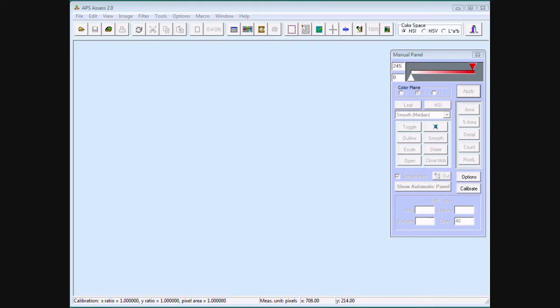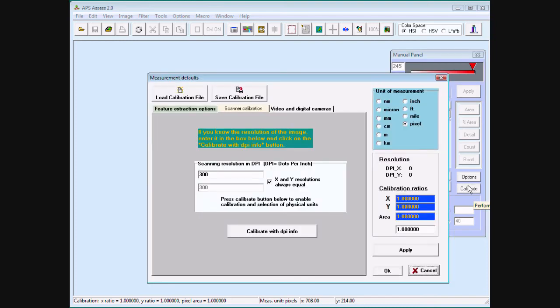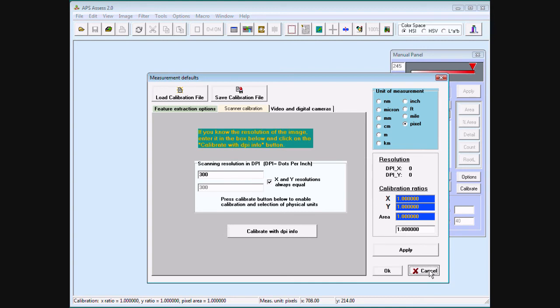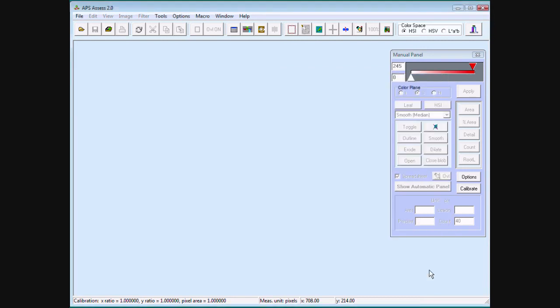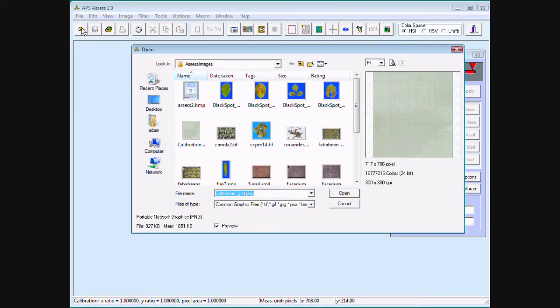The image is brought into a new bitmap, can be saved or edited as you see fit. Images that are not scanned by Assess may need to be calibrated. If you know the size of the image, you can press the calibrate button and enter it in scanner calibration. Otherwise you may have to open an image with a known area.